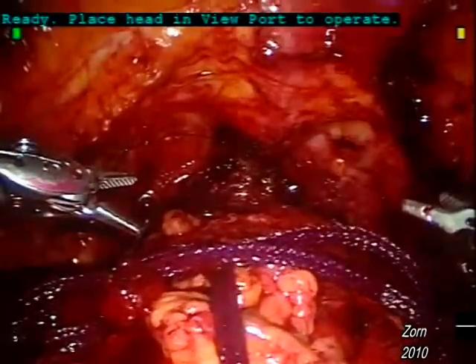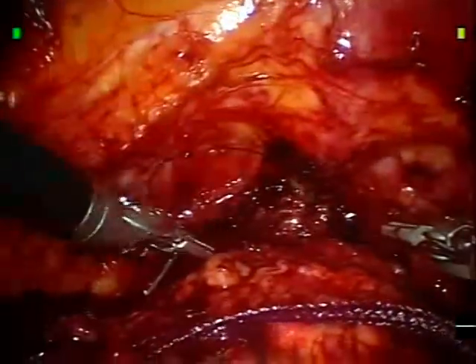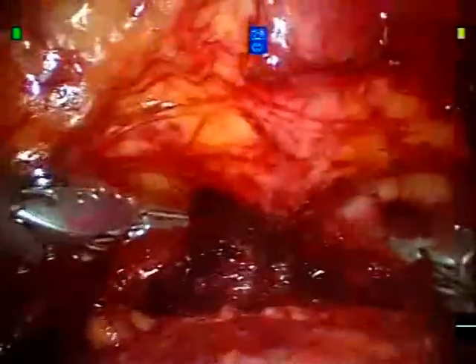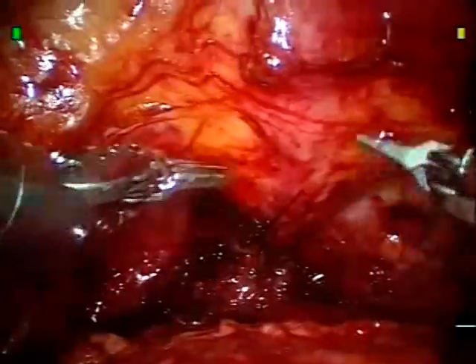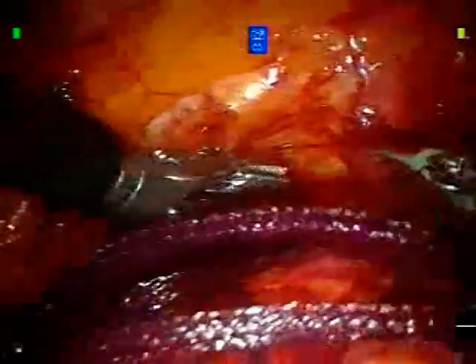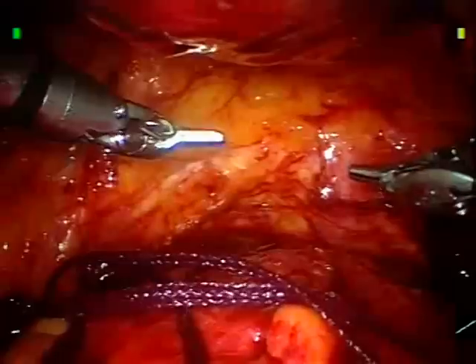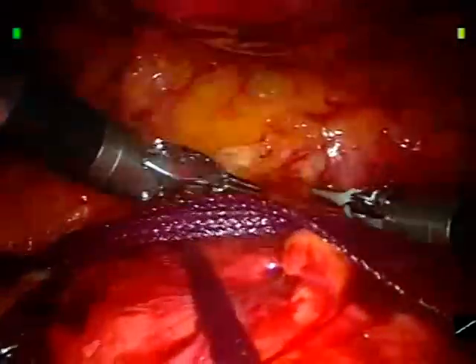Prior to case completion, we always ensure a watertight closure with 300 milliliters of water. The assistant has already inserted 60 cc's into the bladder through the catheter and will continue to infuse 60 milliliters of saline into the bladder. Direct inspection afforded by robotic technology is incredible. In the event that there is a leak, further sutures are placed or the previous sutures can be re-tightened and re-cinched. Here we now have 240 milliliters, with the anterior and gutter spaces being checked for any leak, and finally the last 60 cc's for a 300 cc cystogram.